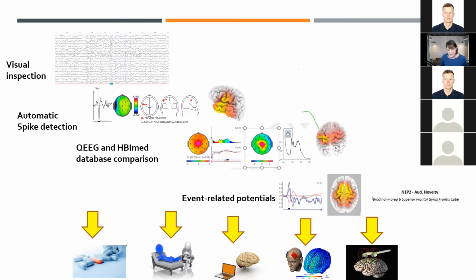The reason for low voltage recording can be many reasons. Of course, we sometimes even see this type of EEG in ADHD cases, but quite often we see this type of pattern in adults or even elderly clients.